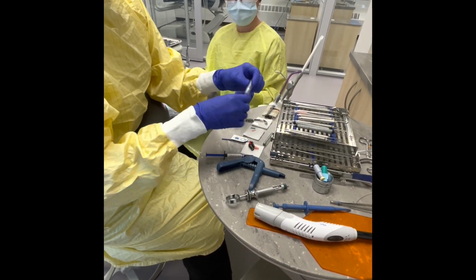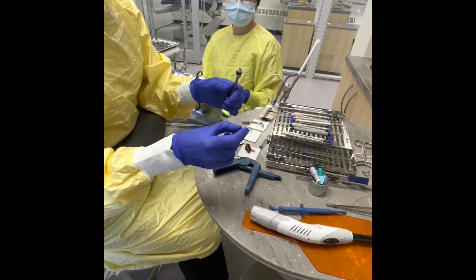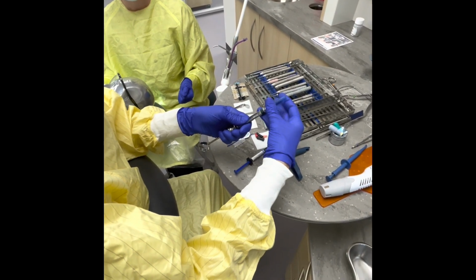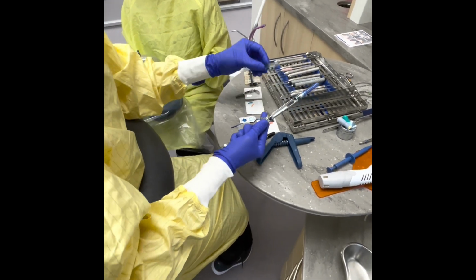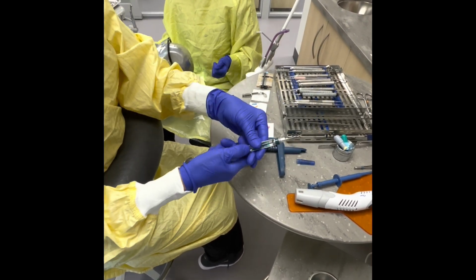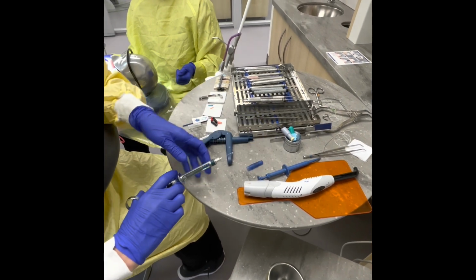So what I'm going to do is click my needle first. I'm going to make sure I have this out so that I can recap it. And with a fulcrum, I'm going to put my needle in. Okay, make sure that you're being safe and you're using a fulcrum. Now I'm going to safely check this and make sure that it's working. I don't want to touch my gauze with the end of the needle. And again, my lid is out so that I can recap it.